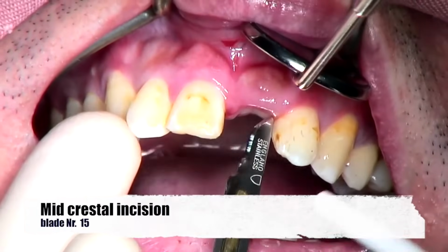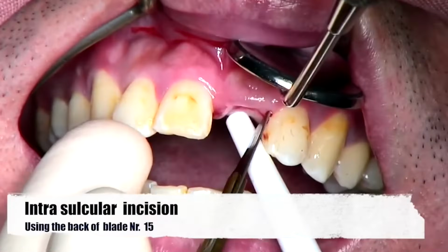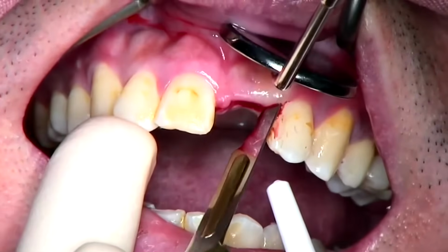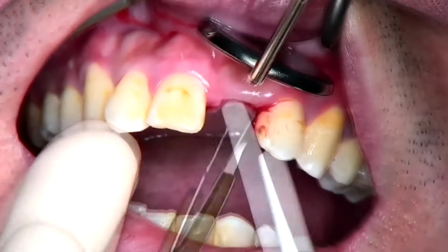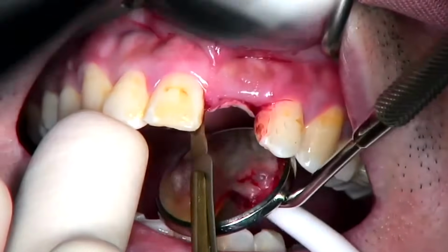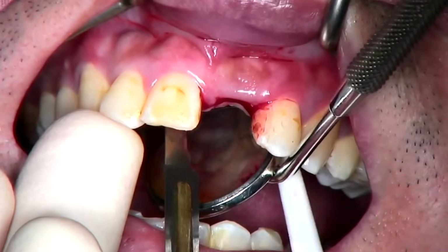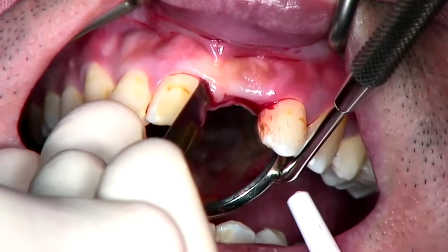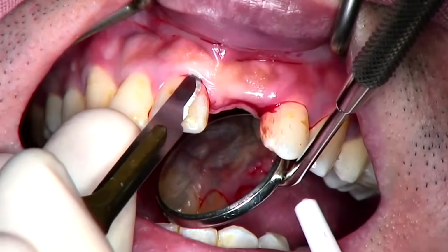After infiltration anesthesia, we start with a mid-crestal incision with a blade number 15. Then we continue with the intrasulcular incision, distal and then mesial of the edentulous space. We continue the intrasulcular incision with the back of the blade to protect the sensitive buccal tissues. We can then complete the intrasulcular incision with a periotome.